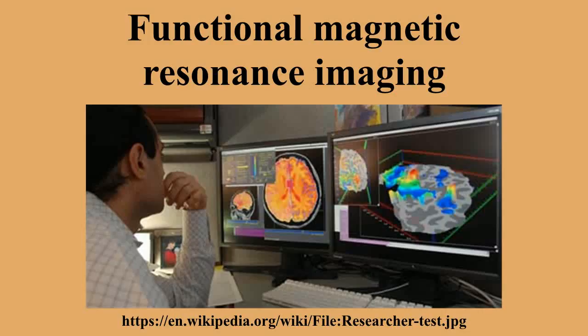Clinical use of fMRI still lags behind research use. Patients with brain pathologies are more difficult to scan with fMRI than young healthy volunteers, the typical research subject population. Tumors and lesions can change the blood flow in ways not related to neural activity, masking the neural HDR. Drugs such as antihistamines and even caffeine can affect HDR.